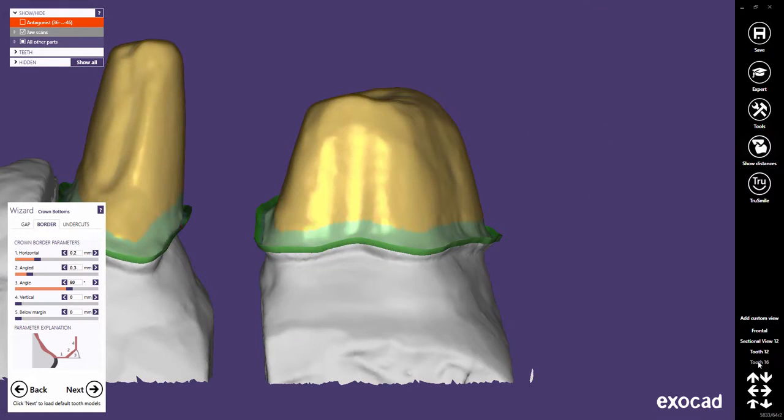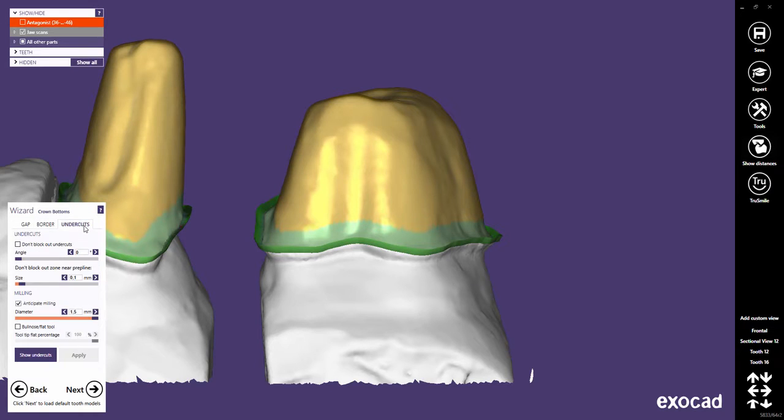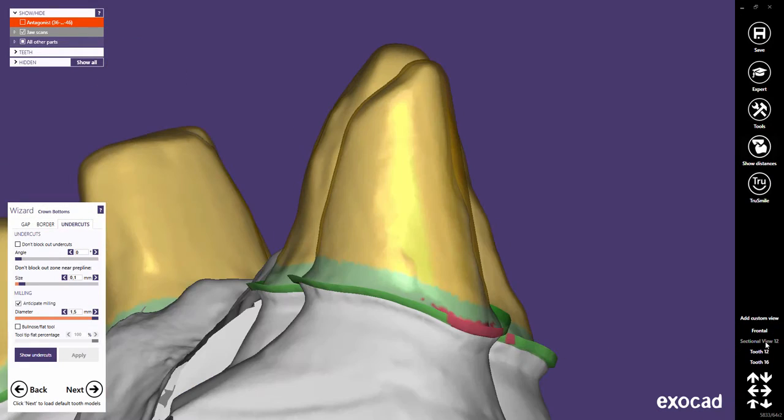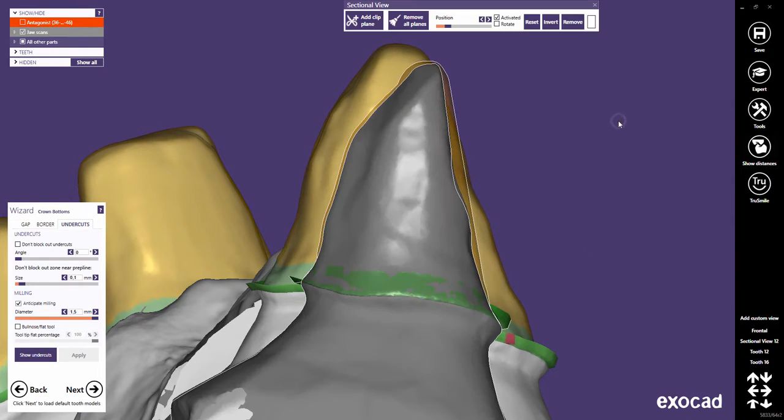The third tab in the Crown Bottoms dialog provides undercut-related options and milling parameters. Another sectional view will help us to understand the undercut and milling parameters.